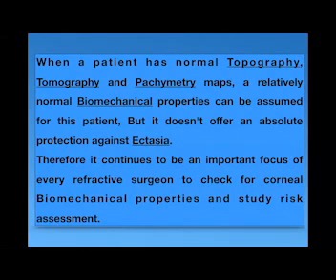In the BAD, which is the Belin Ambrosio display, which is 10 years old now, he said that the corneal biomechanical entity is added to a new module. It's called the BAD-D and BAD-DI, which is the new adjustment of the old BAD display.